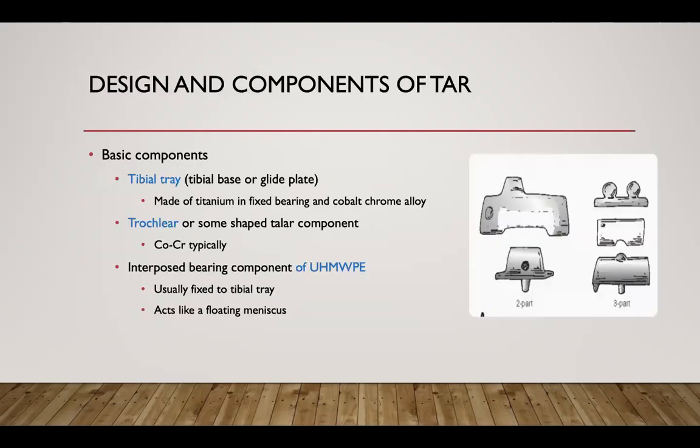So there's many designs for the TARs, but the basic components, you have your tibial tray, your talar component, and then you've got this in-between layer of ultra high molecular weight polyethylene. So these are the two, that's a 2-part and that's a 3-part design.